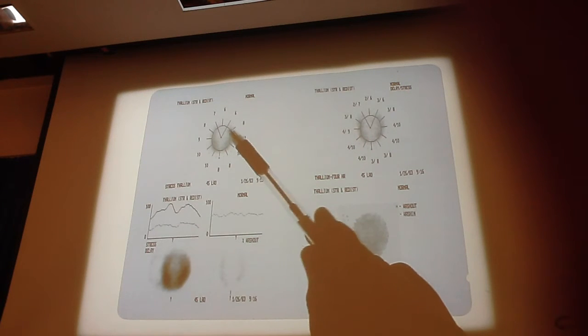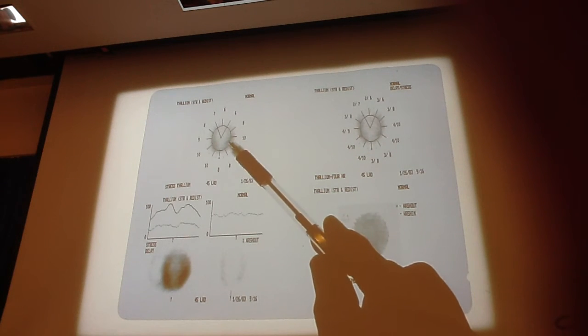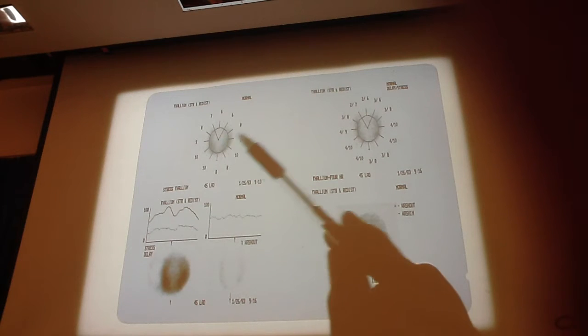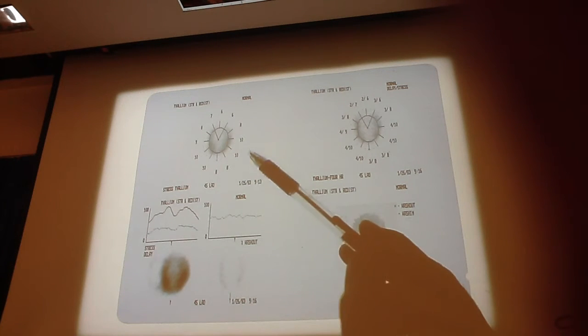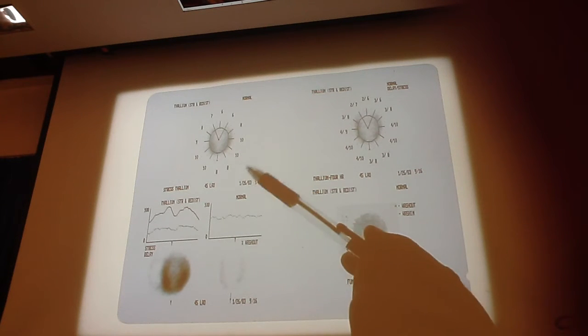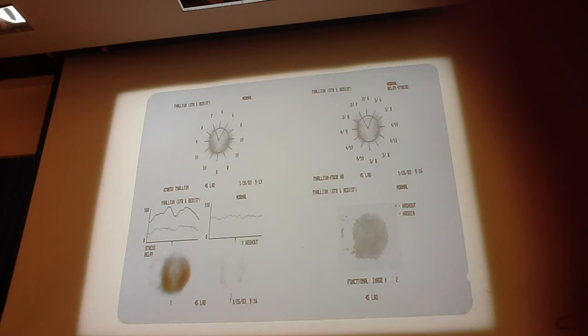Okay. Yeah, basically, this was a test that was done with just planar imaging. Basically they would do a 10-minute picture of the heart in anterior LAO and either a 70-degree LAO or a left lateral. So you get 3 different pictures of the heart in those positions. Okay.